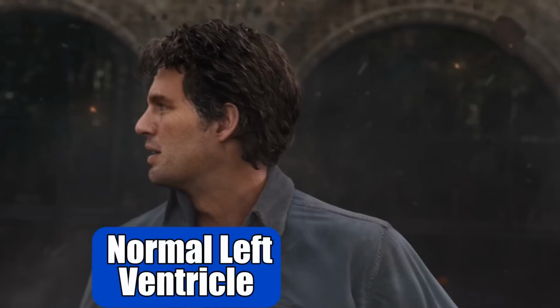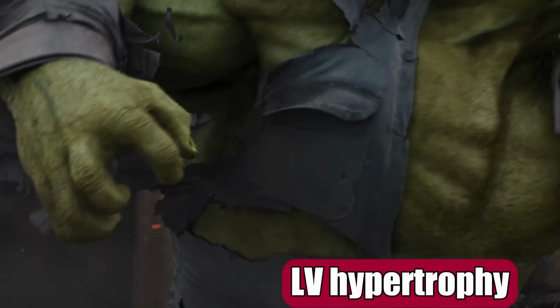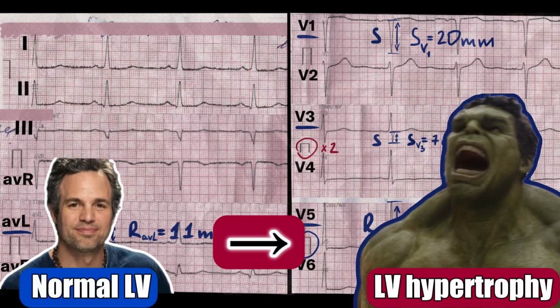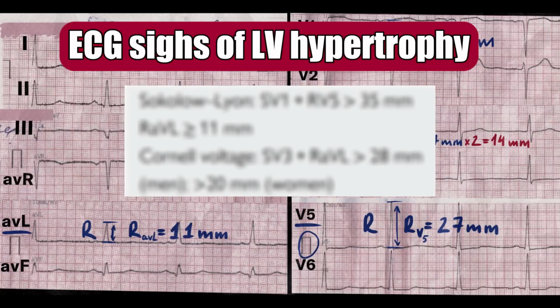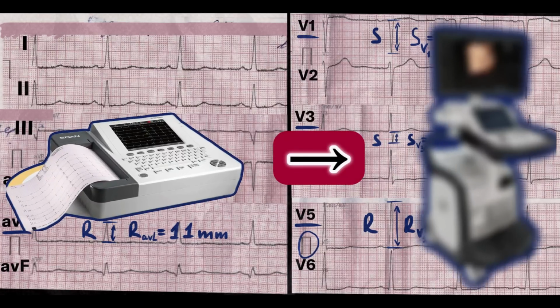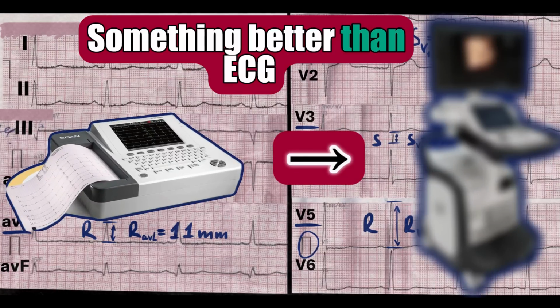I'm always angry. Left ventricular hypertrophy is a transformation of the normal left ventricle, or Dr. Banner, to the Hulk. However, we can spot this transformation by 3 easy ECG criteria. But we will go further and find something better than ECG.